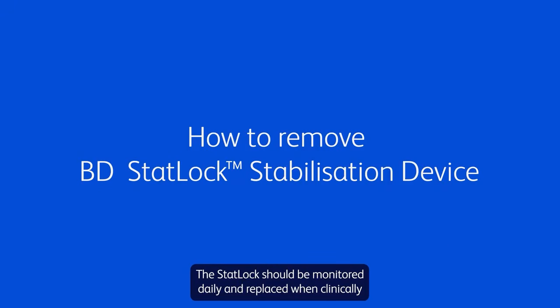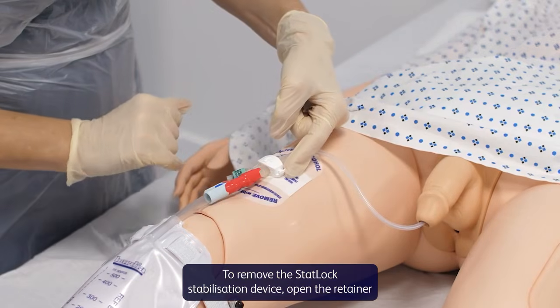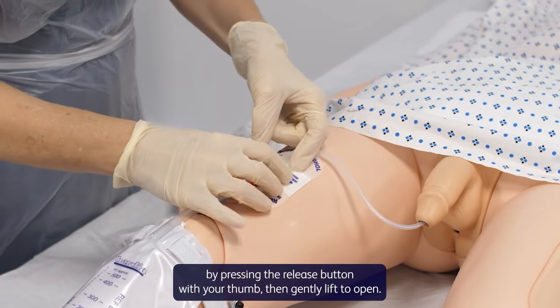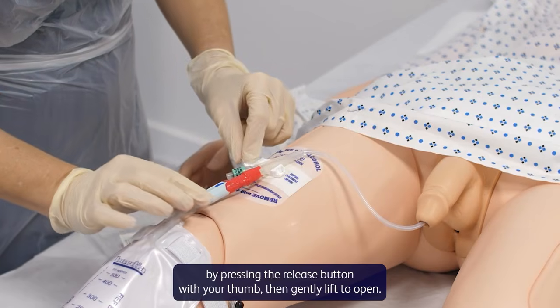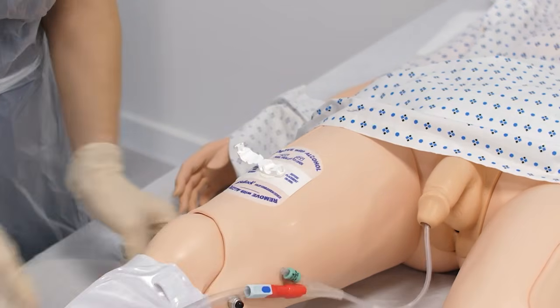The StatLock should be monitored daily and replaced when clinically indicated, at least every 7 days and ideally on alternate legs. The StatLock stabilization device has a very strong adhesive, so it is vital that it is removed correctly. To remove the StatLock stabilization device, open the retainer by pressing the release button with your thumb, then gently lift to open. Remove the Foley catheter.